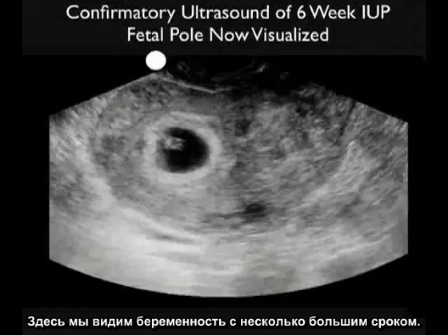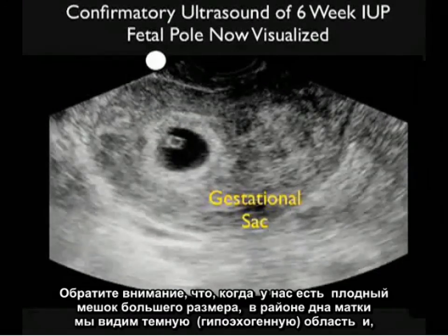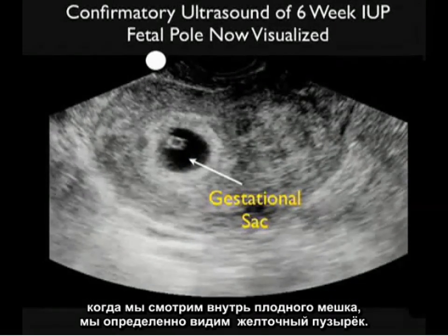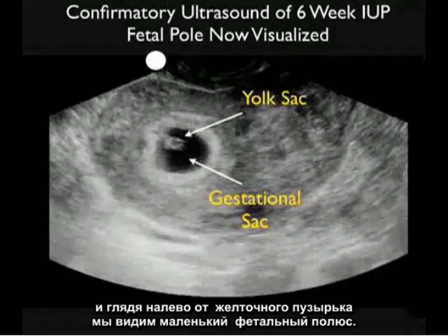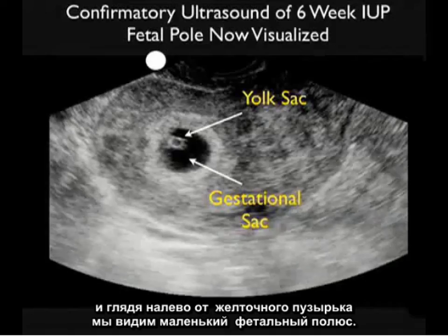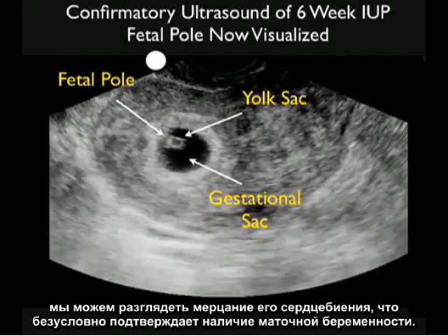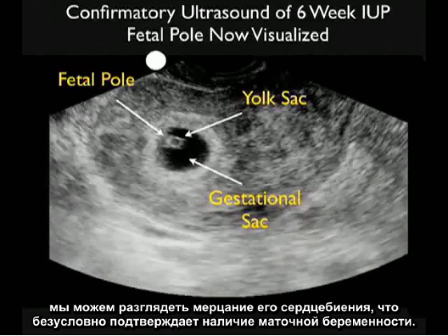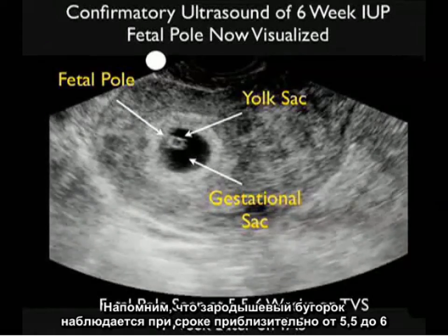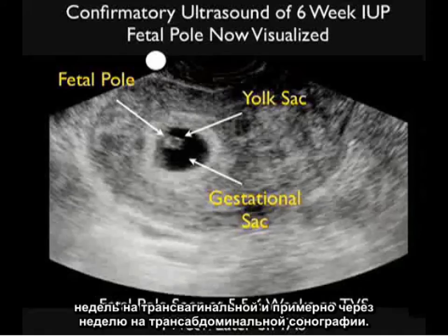Here we see a pregnancy that is a bit further advanced. Note the larger gestational sac — the darker hypoechoic area within the fundal region of the uterus — with the positive yolk sac or cheerio visible inside, and just to the left of the yolk sac, a tiny fetal pole. Zooming in on that fetal pole, we can make out the flicker of a heartbeat — a definitive intrauterine pregnancy. The fetal pole is seen at about 5.5 to 6 weeks on transvaginal sonography and about a week later on transabdominal sonography.